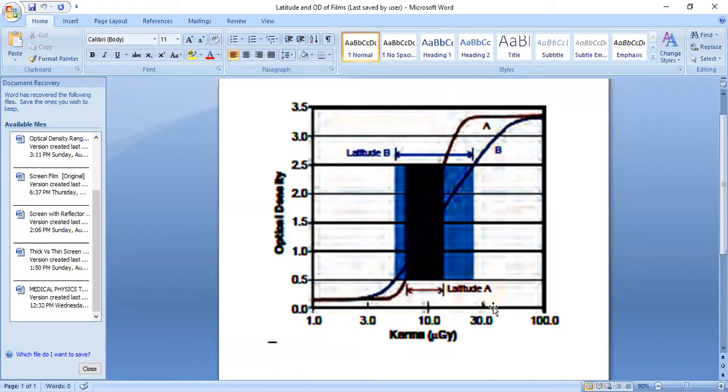We won't buy a particular film, maybe you now have several films, maybe 10 packs of film, just because of a particular radiography. It is not cost effective. You buy a particular film and you use it for all the patients, all the cases that one encounters. You are not going to be picking, okay, I want to use this particular film for this patient because I'll be using this exposure range, I'll be using 80 kVp, I'll be using 20 mAs and so on.